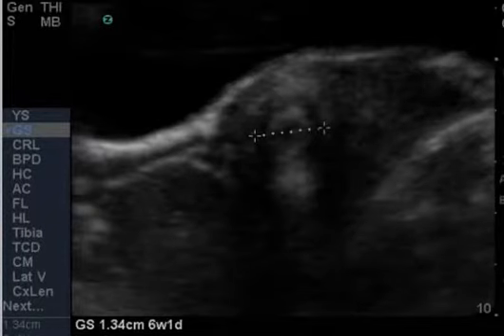So this is an OB ultrasound. Your clips are perfect. I do not see a clear IUP. The reason for making this video is just to go over measuring the gestational sac here, which you did, but also to go over some of your other options here.